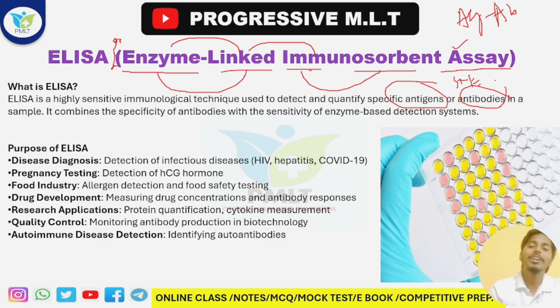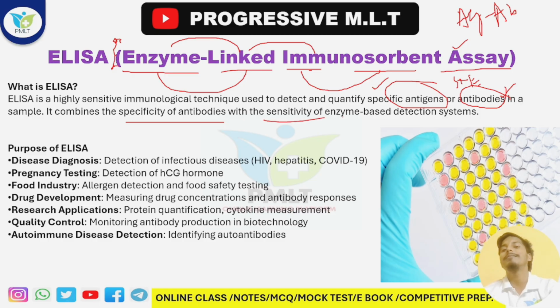If we detect the antigen, it proves that the particular pathogen is present. Or if we detect the antibody, that also proves that this pathogen is present, so that the antibody is developed. Now, ELISA combines the specificity of the antibodies, meaning that this particular antibody is present and is detected by the ELISA, with sensitivity, which helps develop the color, and this color helps detect that this particular antibody is present. That's the basic idea about ELISA.